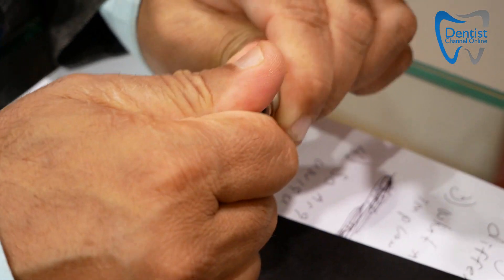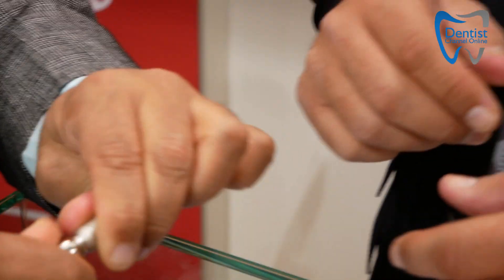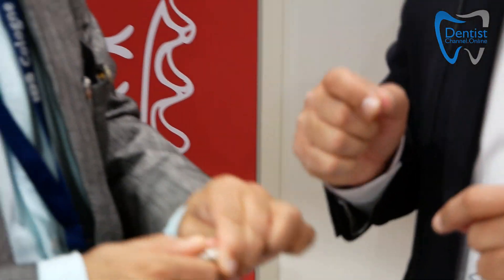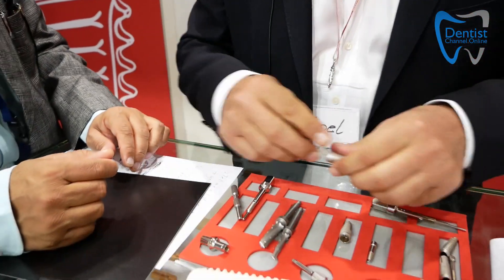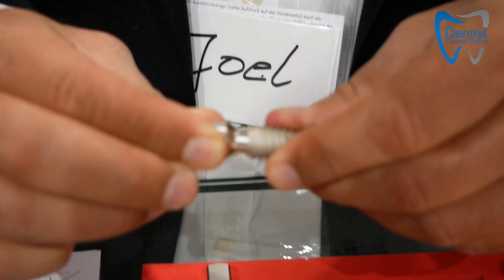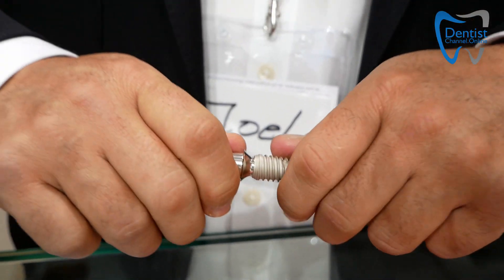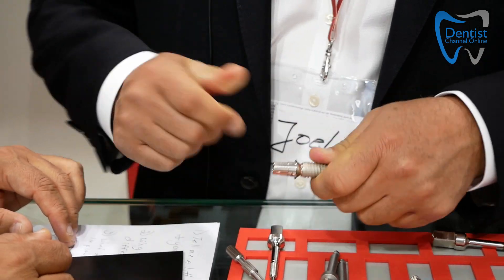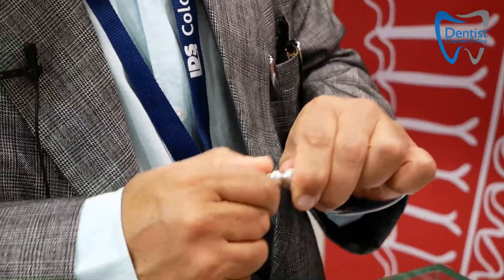Can I do it? Absolutely. This is the benefit of the 1.5 degree true Morse taper. Now let me try to separate it — this will not come apart. I separated it, but let me use this one. You put it in — boom, you see it drop into place. Now let me purposely push this a little bit harder. Now try to separate it. There's no screw in there — it's locked in place.